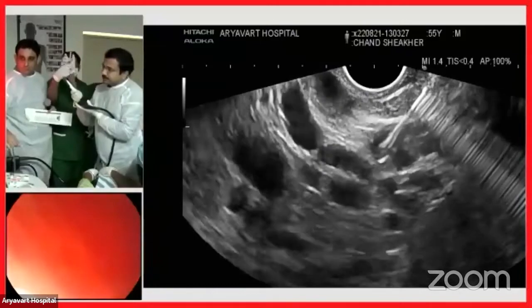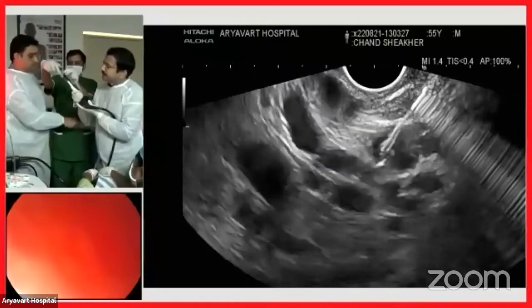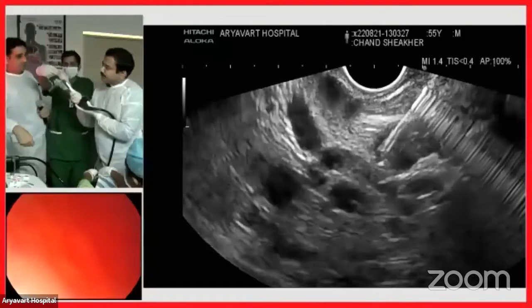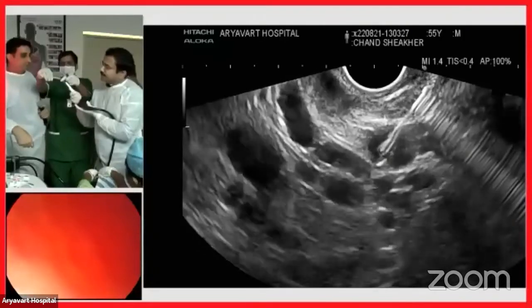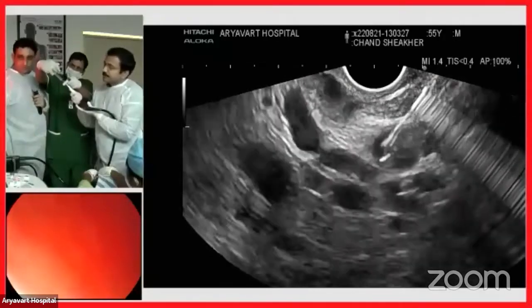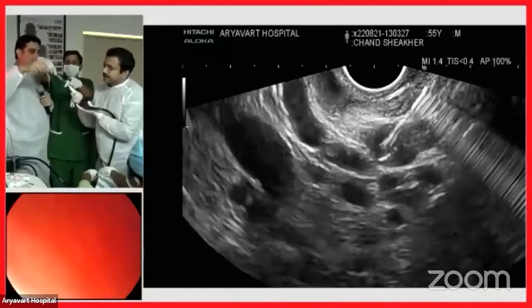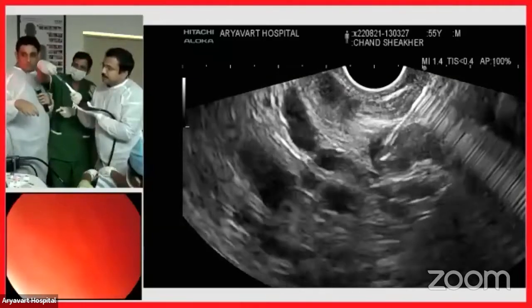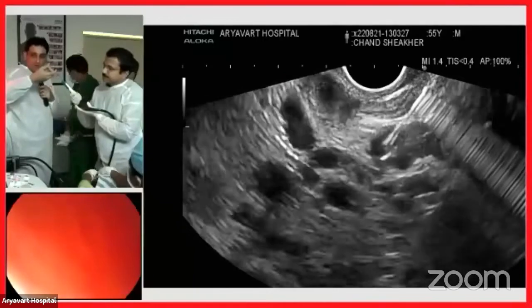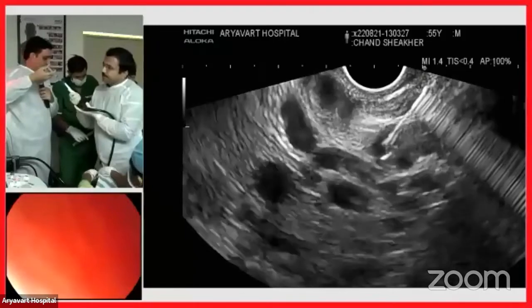We are inside the varix now — we can clearly see it. We aspirate slightly and flush — blood is coming out, so we confirm intravascular position. Now we start flushing with dextrose. Keep flushing so that by backflow the blood doesn't come back. Now open up the needle — I'll keep flushing in between so it doesn't get blocked — and then open up the coil.